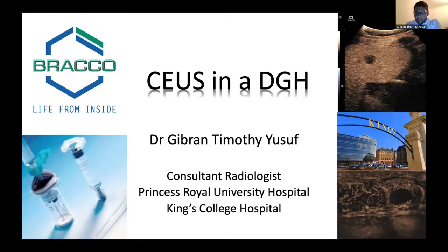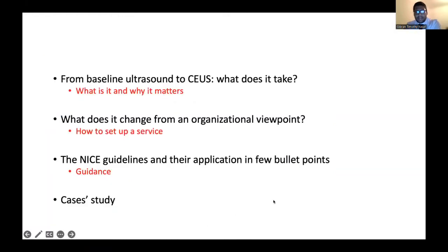And as my former speaker said, we'd be a fool to think that liver disease is restricted to tertiary centres. It's simply not the case. The burden is rising to such an extent we have to be aware of these techniques. So here's what I was asked to cover within this. I was asked to cover from baseline ultrasound to contrast enhanced ultrasound. In the red is what I interpret this as: what is it and why does it matter?